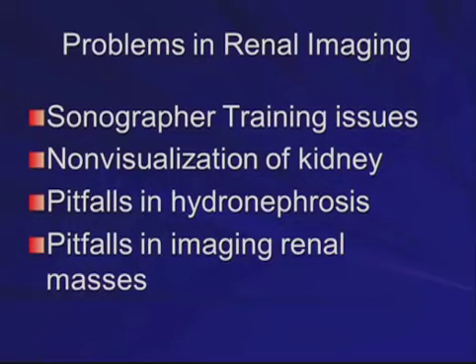Well, why do we miss lesions in the kidney? Well, I'm going to divide this talk into 4 different topics because these are the major reasons why we're missing lesions, and they include sonographer training issues, non-visualization of kidney lesions, pitfalls in hydronephrosis, and then the pitfalls we see in imaging renal masses.